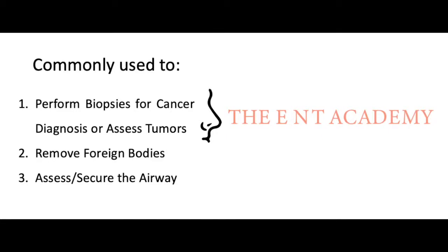Rigid laryngoscopy is commonly performed when taking biopsies for cancers, removing foreign bodies, and assessing and securing the airway.